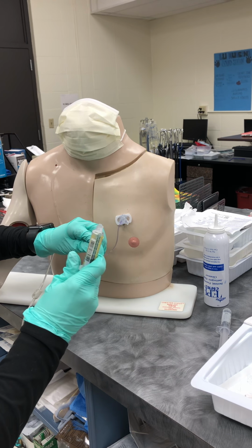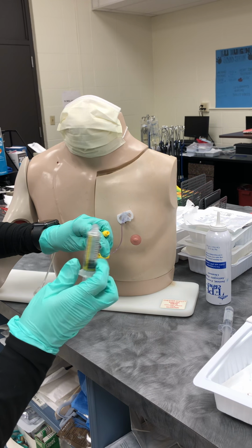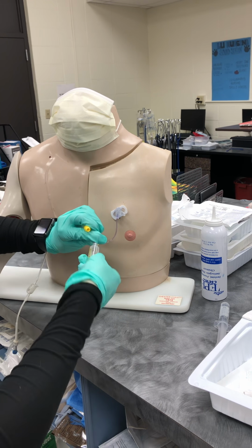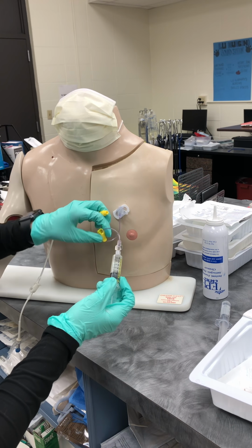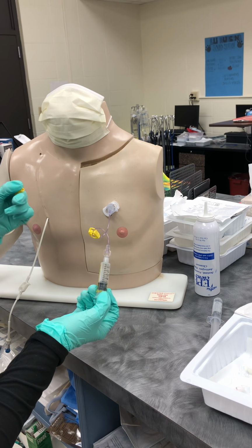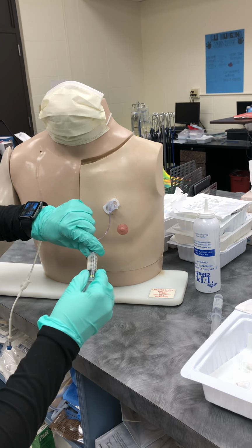attach your heparin syringe. And you would flush with 5 cc's of the heparin. Make sure that you unclamp before you flush. Again, with the mannequin, we can't actually flush it. So we're going to lock off and remove this.